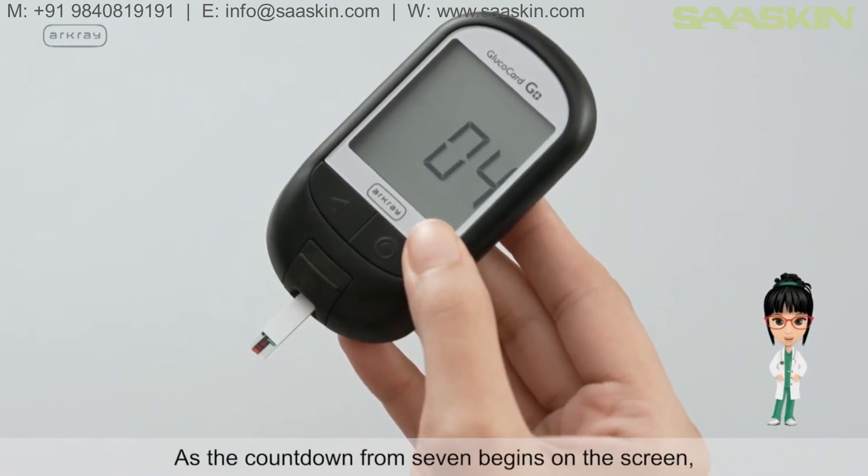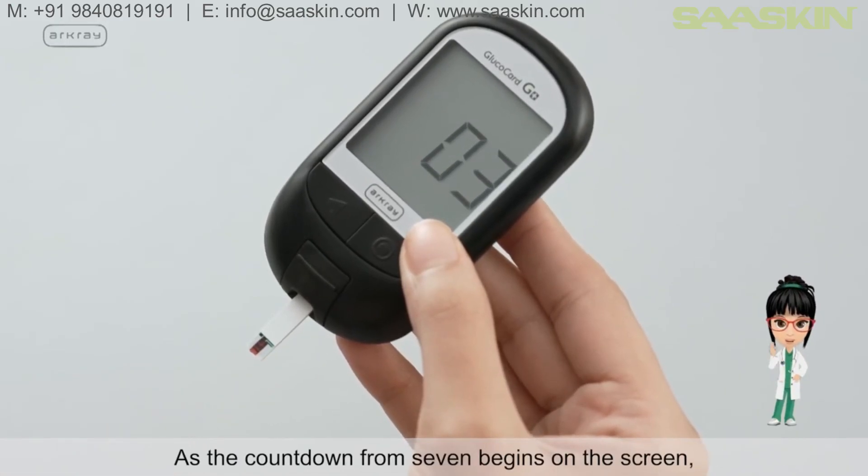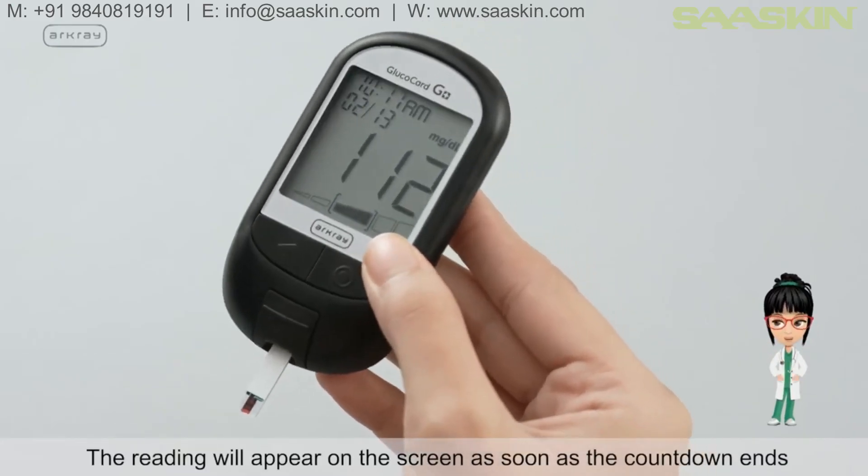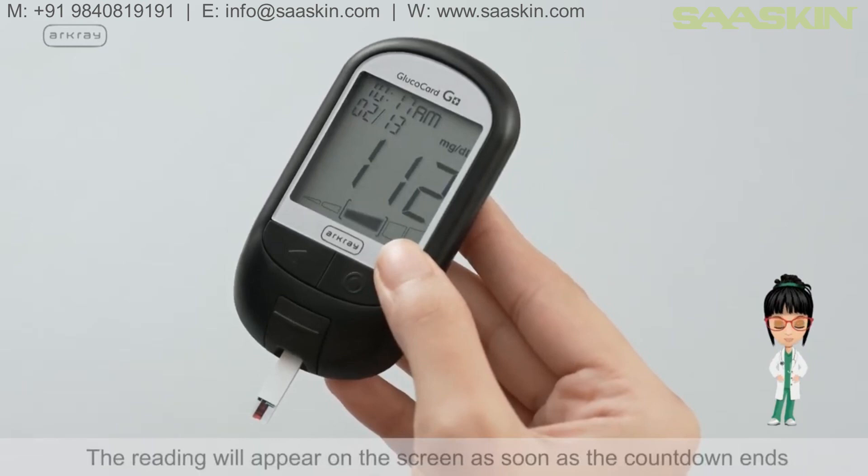As the countdown from 7 begins on the screen, remove the device with the strip from the blood drop on your finger. The reading will appear on the screen as soon as the countdown ends.